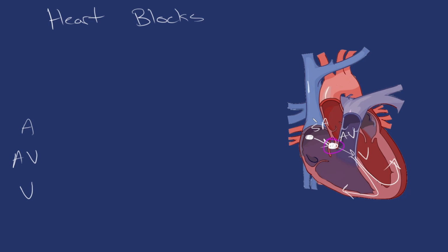So this can happen because either the AV node isn't able to take the signal or it's hanging onto it for too long for whatever reason. Okay, so if we draw out our first kind of rhythm here, we'll do the laddergram here again, right? We see here that the AV node, the PR interval, okay, this is way, way too long. If we draw down, right, we'd have here, and then kind of eventually it's sent it down.